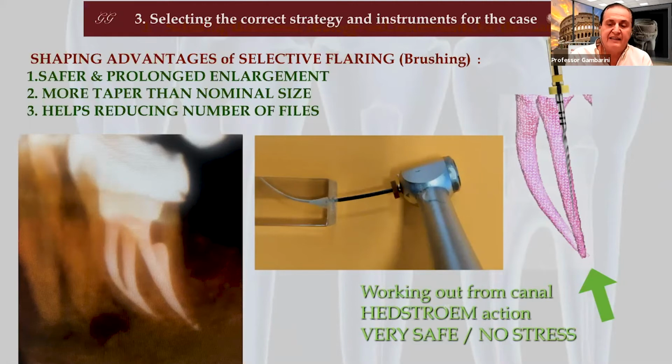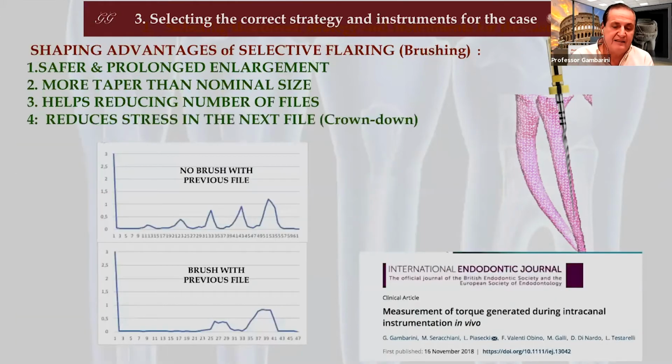And when I need more flaring, I can flare, but only when I need it, not by definition because I'm using a file with a greater taper. And obviously, if I do this, it helps quite a lot in reducing the number of files.